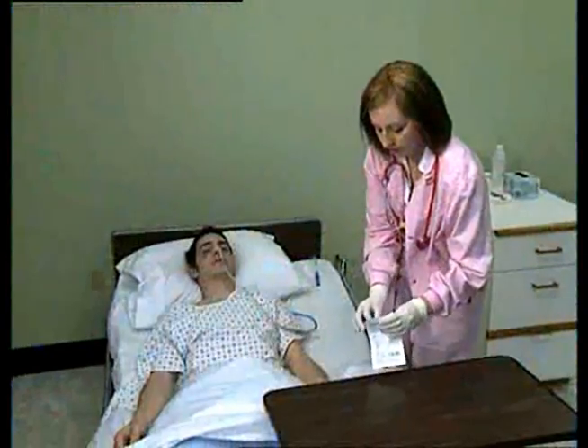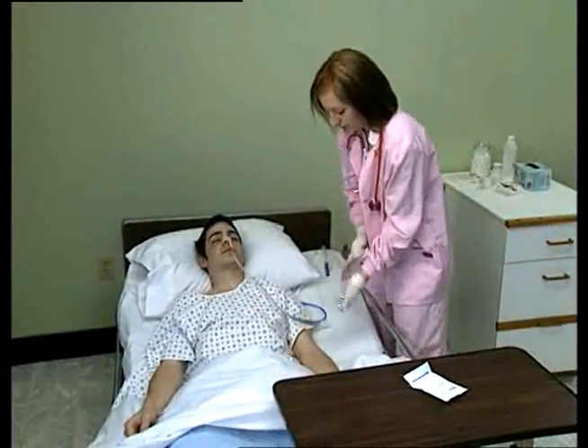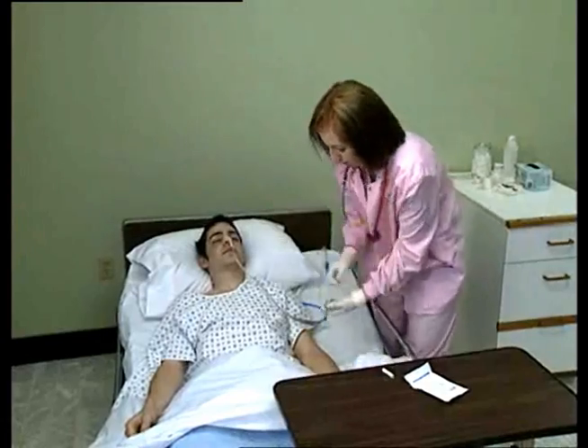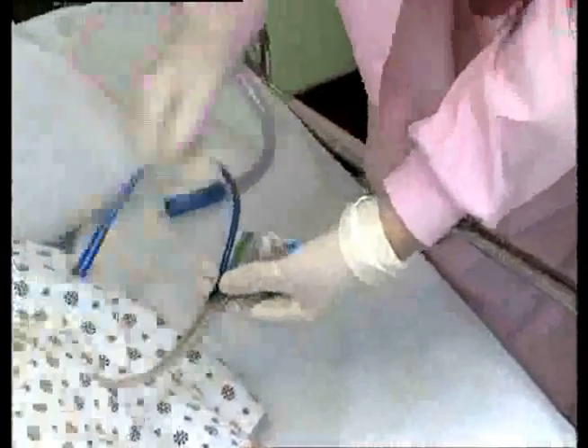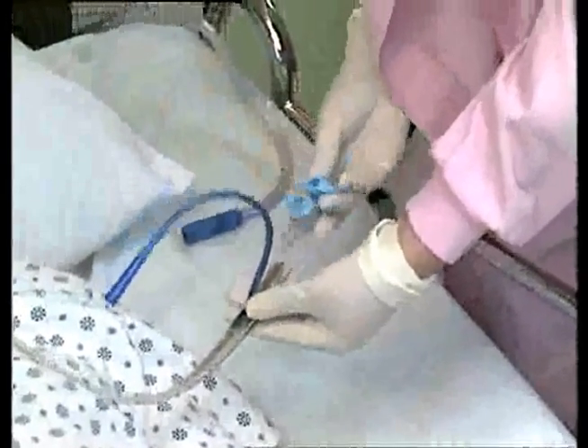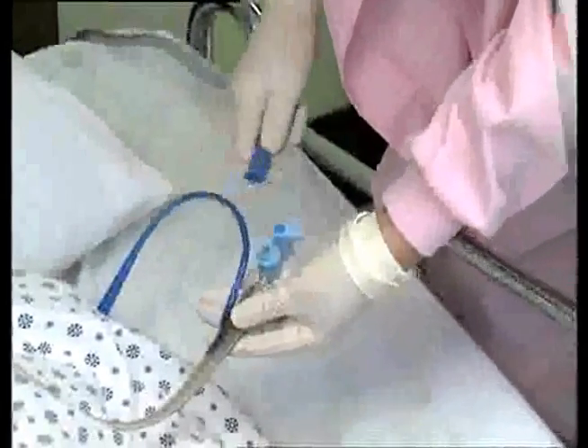Start by removing the Dale ACE Connector from the package. Remove the white flexible adapter from the ACE Connector and remove any 5-in-1 connector that may be on the patient tube. Attach the patient tube to the catheter connector end of the ACE Connector and attach suction tubing directly to the connector.